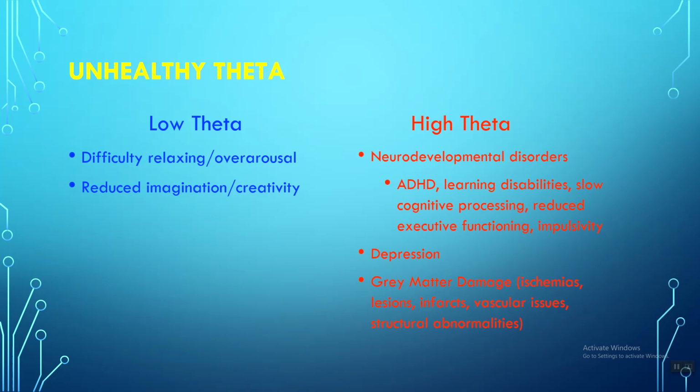But for now, we're being empiricists and scientists, and so focal theta especially is going to represent an issue with the gray matter of the brain, with the bark of the brain. Low theta, a deficit in theta, often means there's a white knuckling occurring. The individual has a hard time letting go, letting down, relaxing, self-soothing. They may have a hard time falling asleep. They may have a hard time staying asleep. Both delta and theta are frequencies of different realms of the unconscious, even from a scientific perspective.